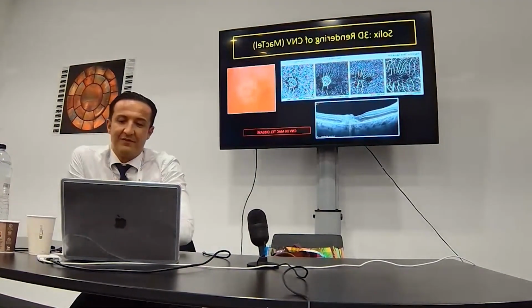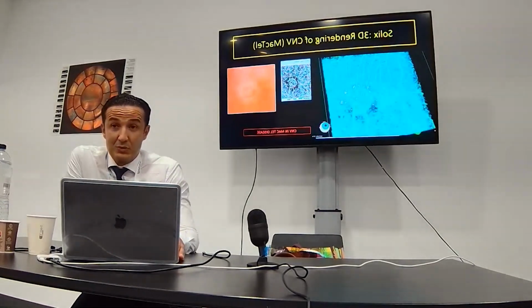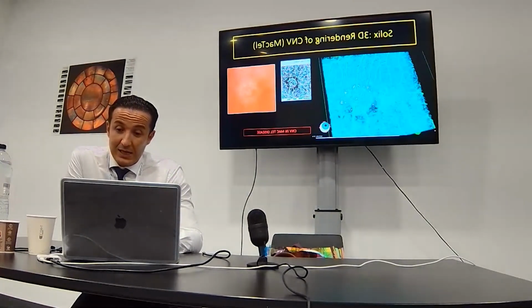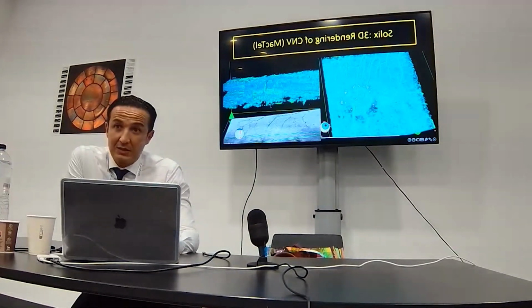Another case of CNV complicated with a macular telangiectasia, and look here, in 3 dimensions, you can see the abnormal connection between the superficial plexus dilated with intraretinal CNV. And look here, this connection with capillary dilation directly in the CNV in three dimensions.